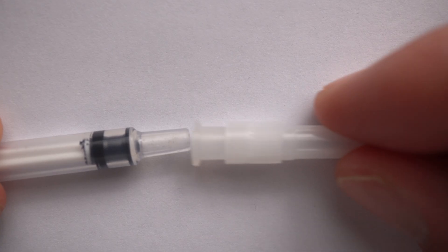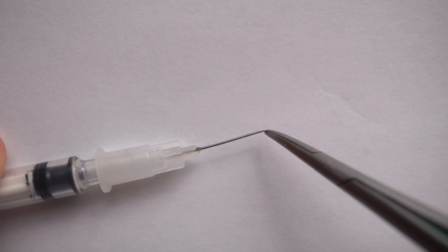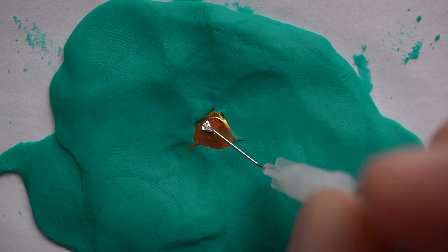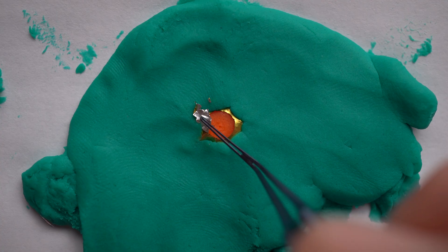Step seven: put your 27 gauge needle on the syringe and bend it twice as shown here — once in the middle of the bevel and once in the beginning of the shaft. Now you can use your needle to do your capsular rexis. Of course, if you have your own forceps, you can also use that.